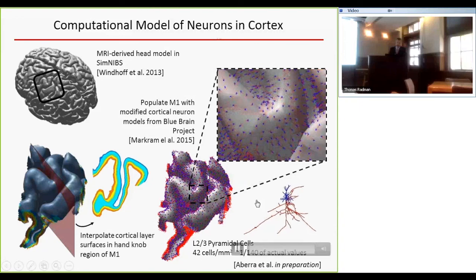And then with these populations, you have the E-field simulation, and this E-field stimulates each of these neurons with the local characteristics of the electric field. And then you can map activation of neural populations for each layer. And even within layers, you have different neural populations. So here you can see what we get out of the simulations. We can get this cortical map where now for each layer, you don't see the layers, just one layer here, but we'll see the layers later.